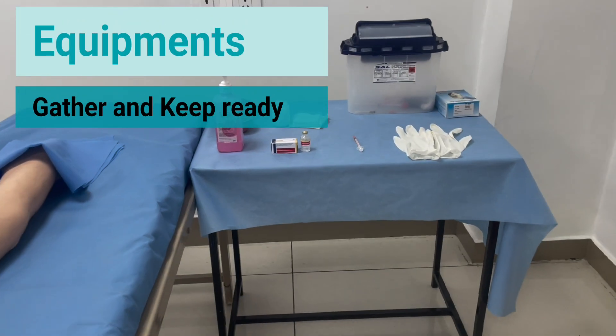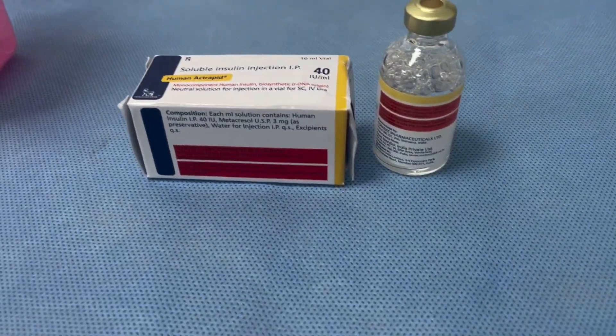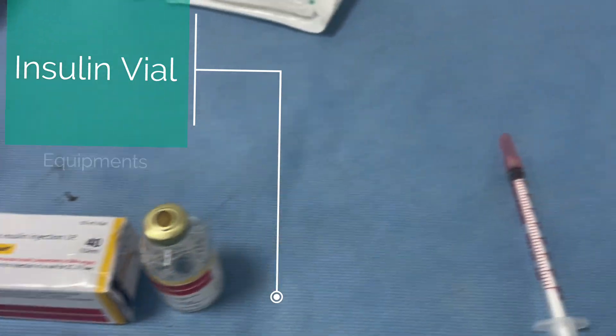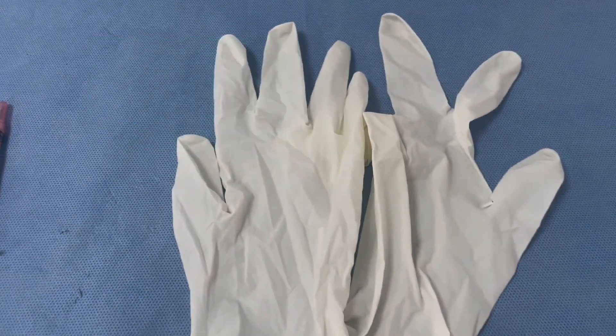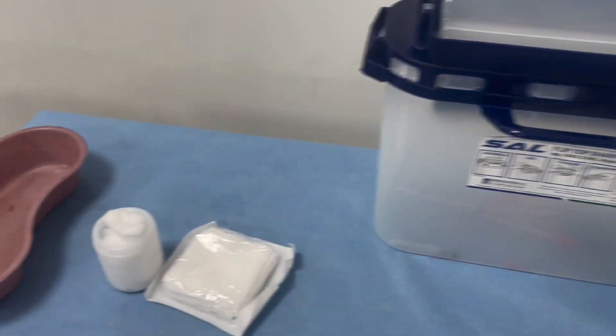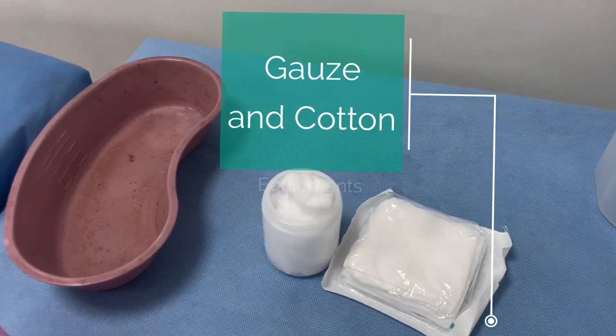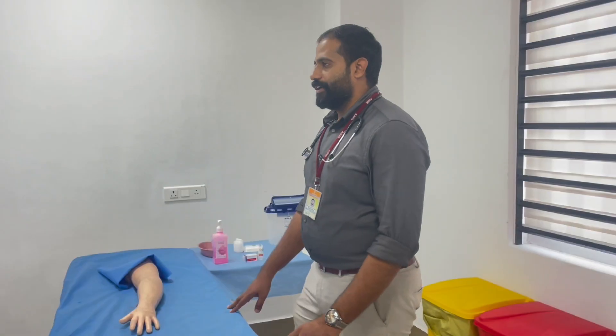As always, first keep ready all the equipment: an insulin vial, an insulin syringe, gloves, a waste disposal bin, gauze as well as cotton, and a hand sanitizer.